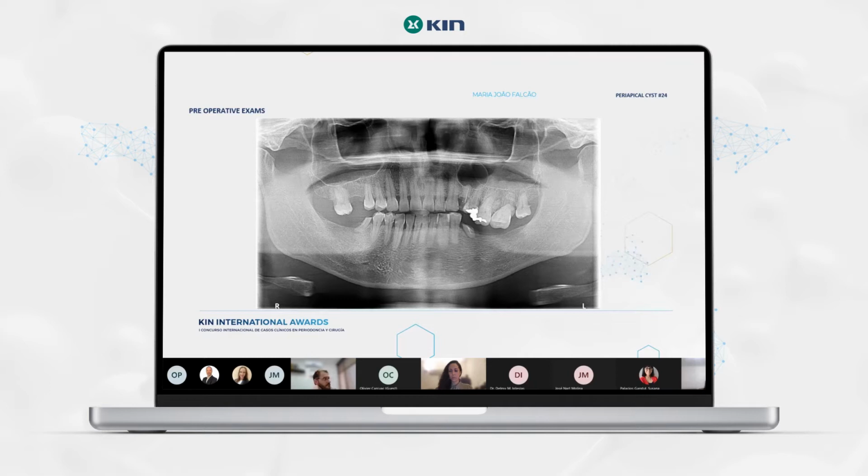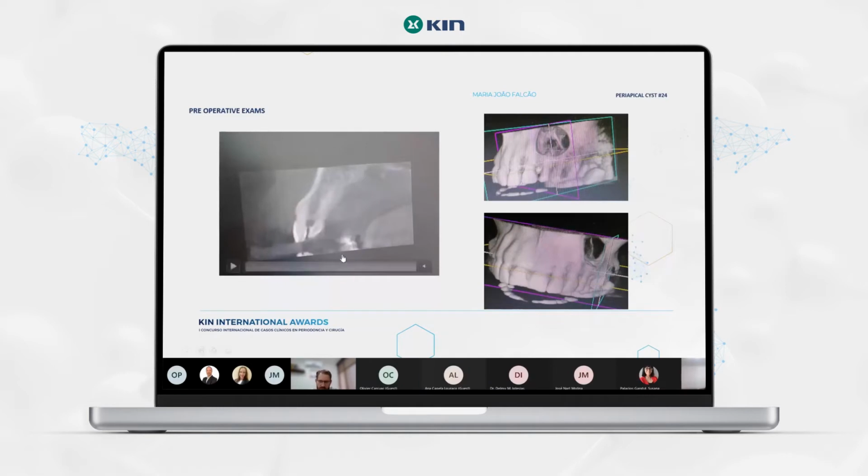After that, he came again so we could do the treatment plan. Because this image is so big and so close to the maxillary sinus, we performed a 3D exam so we can see how big it is, and also if we have any communication with the maxillary sinus, which is important. You can see here in the 3D images that we don't have any cortical bone in the vestibular.